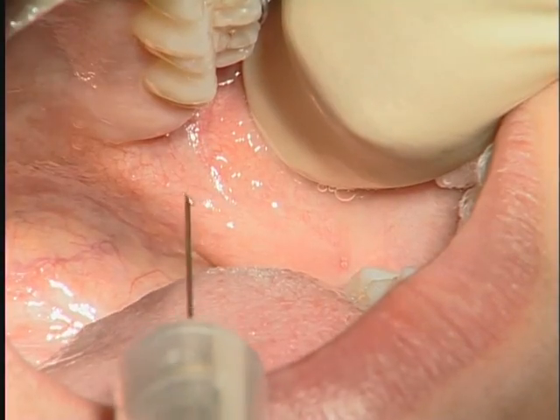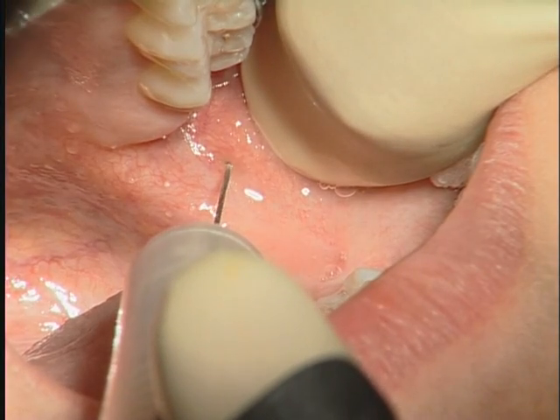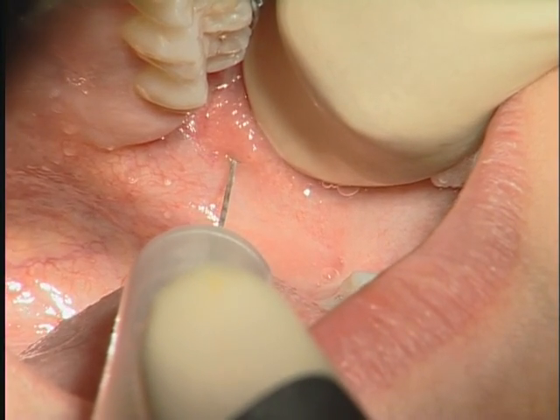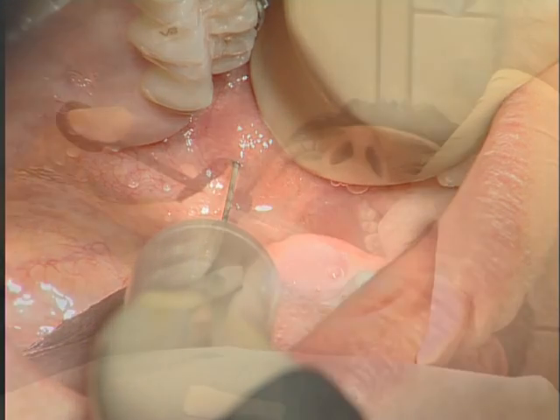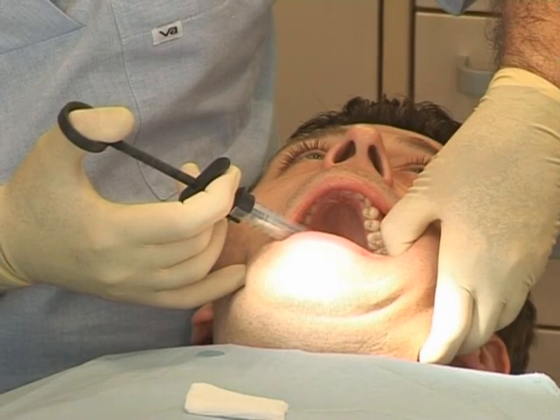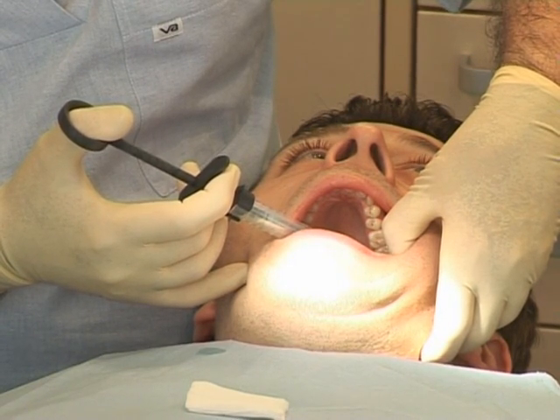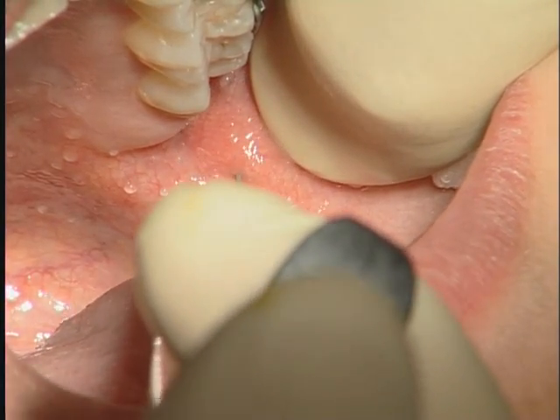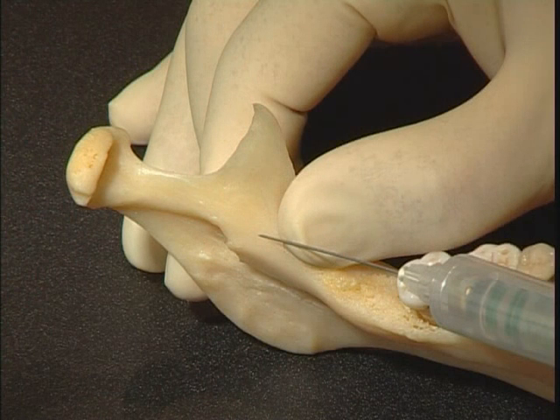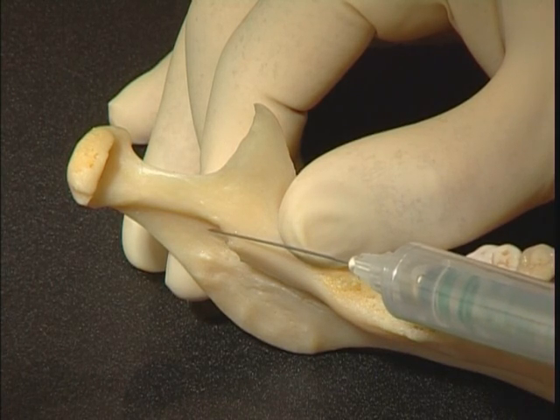Your injection point is 5 mm behind this, and you penetrate until you feel the tip of the needle touch the bone. The syringe should be orientated along the axis of the second premolar, or even the first molar, as it is always easier to correct the axis from the back to the front than the opposite way. The bevel of the needle must face the bone surface so that it slides better, and you can, if necessary, correct the trajectory by moving the needle slightly.